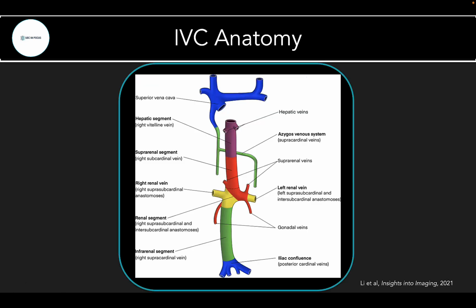So first, let's quickly review the anatomy of the IVC. This is a helpful diagram that shows different parts of the IVC. And we just want to remember that with POCUS, we are scanning the intra-hepatic part of the IVC, which is shown here in purple. And we can see it insert into the right atrium, and note that it does that right at the level of the diaphragm. And we can see the hepatic veins drain into the IVC, which enter just before the RA caval junction.